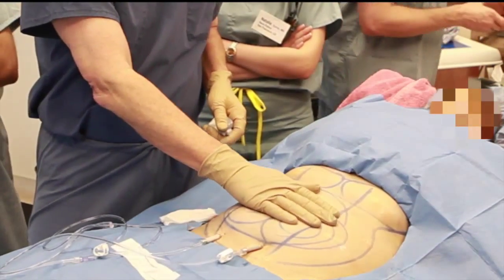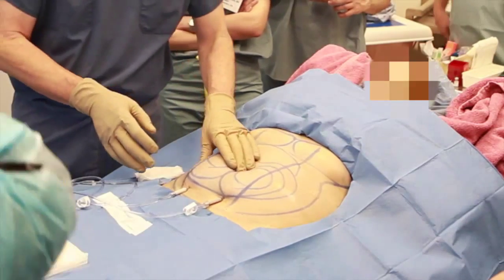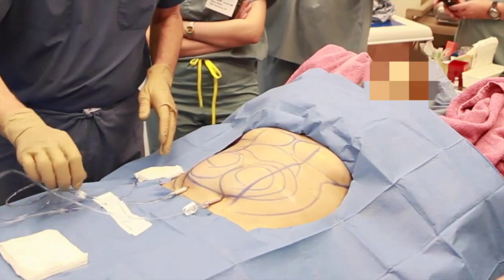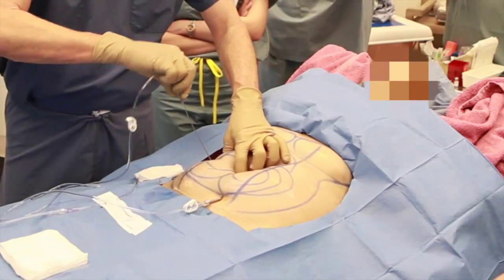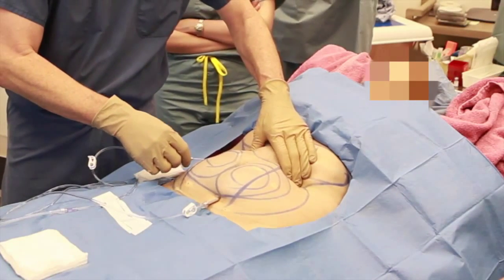Now we're actually pumping fluid into the abdomen. It's gradually becoming more tumescent and we can feel that it's becoming swollen and firm. After a sufficient area of tumescence has been created, we'll change the entrance sites and go through different adits until the entire abdomen is well anesthetized.